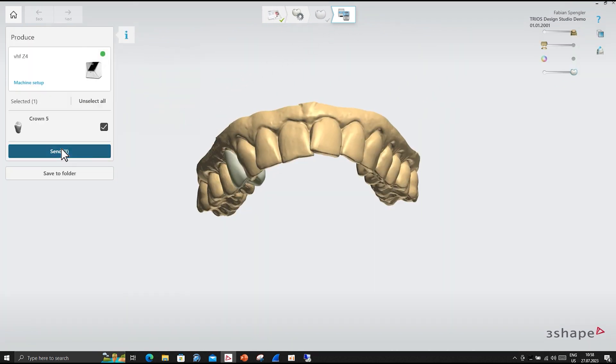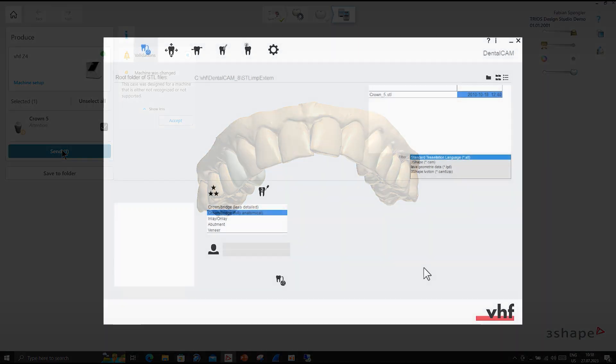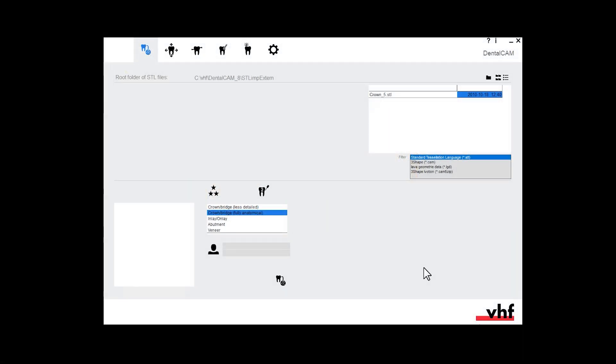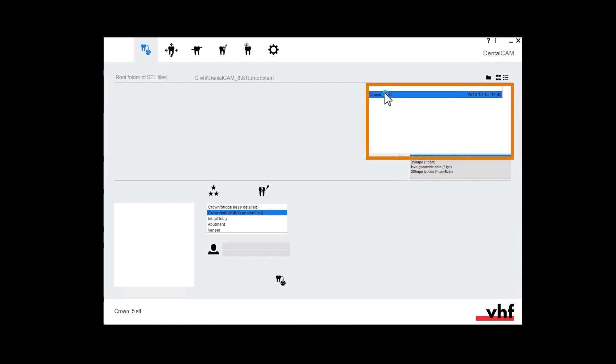Access the CAM computer. Switch to DENTALCAM. Open the STL import view. The STL file displays in the file list. Select it.